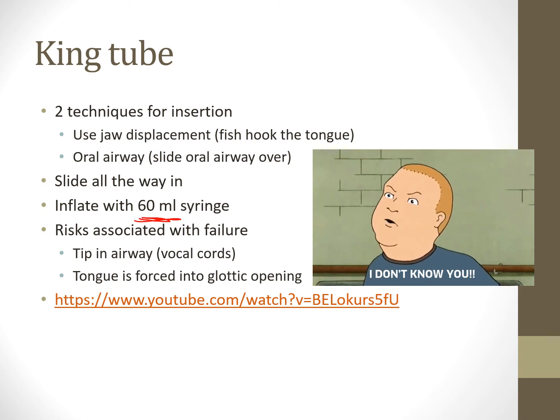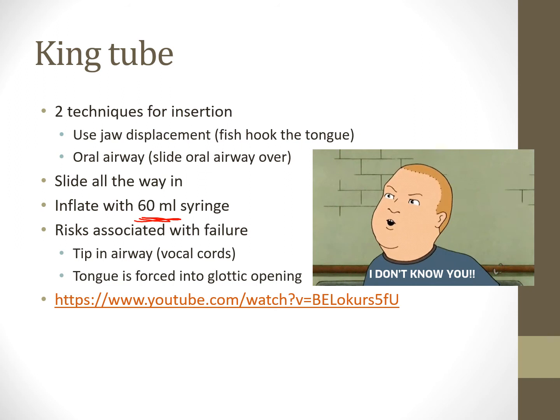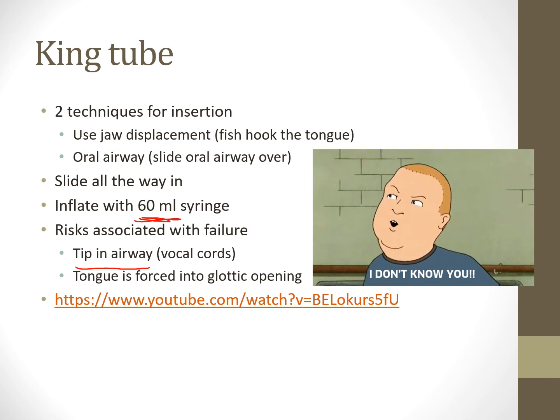Large volume syringe. You might have an issue if you don't put it in the right place. If you put it into the airway somehow, instead of the esophagus, you're not going to be able to ventilate very easily. Or if you push the tongue against the glottic opening, the tongue sort of got pushed out of the way, you didn't move it out of the way enough, that could also be another issue. So you need to be able to troubleshoot these as well.